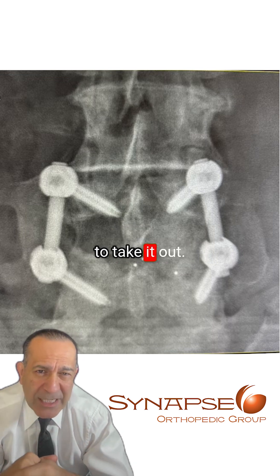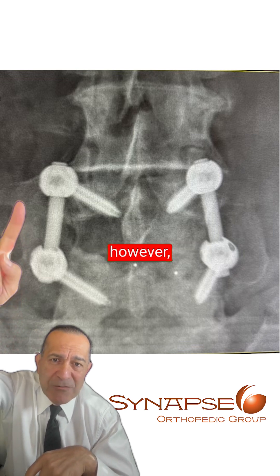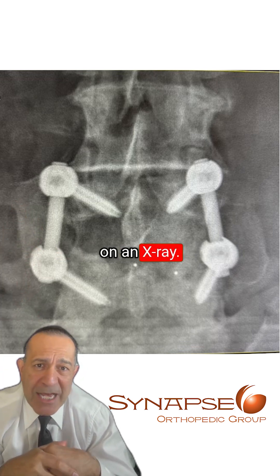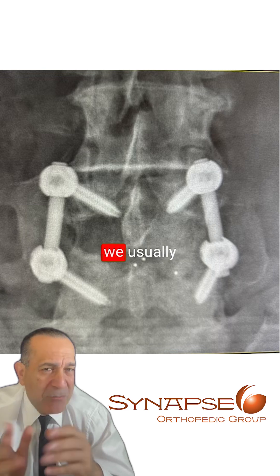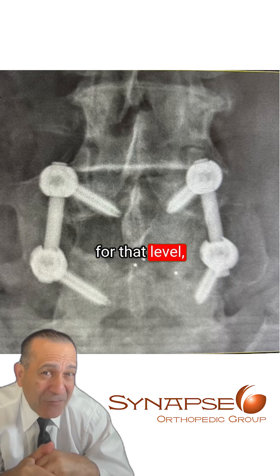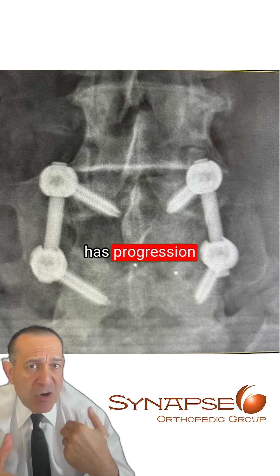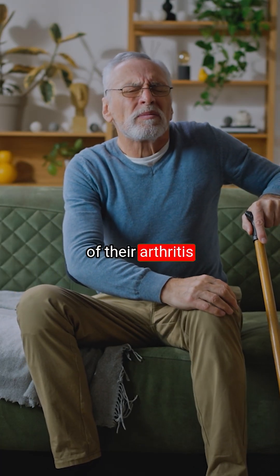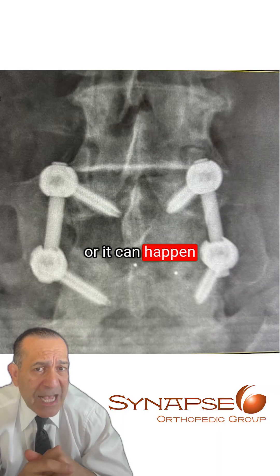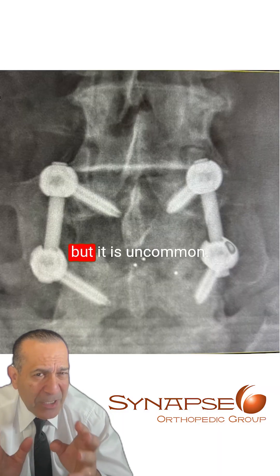Occasionally, we have to take them out. This bridging bone usually takes a couple of years to develop to be seen so well on an x-ray. And once that happens, we usually feel good that there is really nothing else to do, at least for that level, unless the patient has progression of their arthritis or disc disease that can happen with age, or due to this fusion, but it is uncommon.